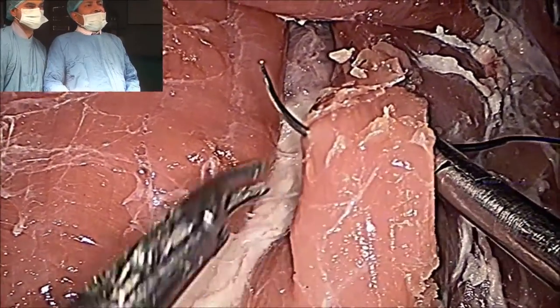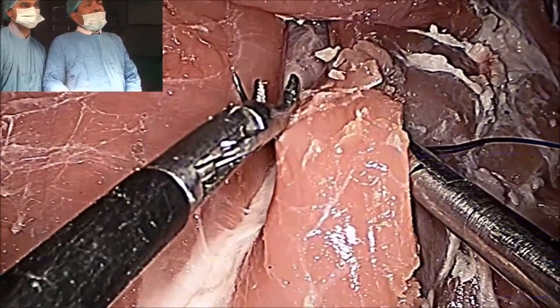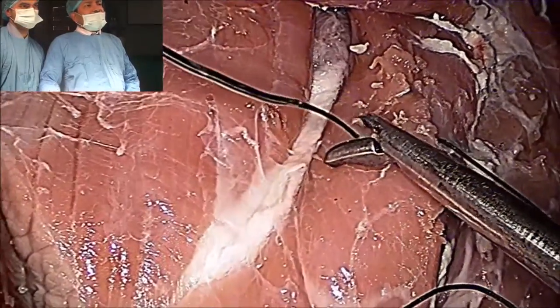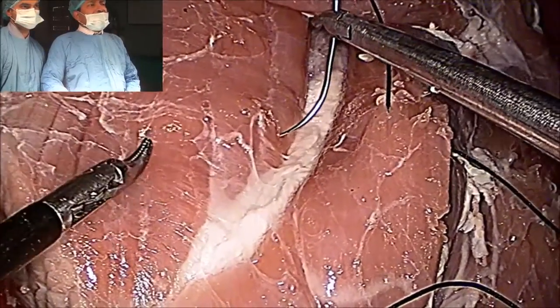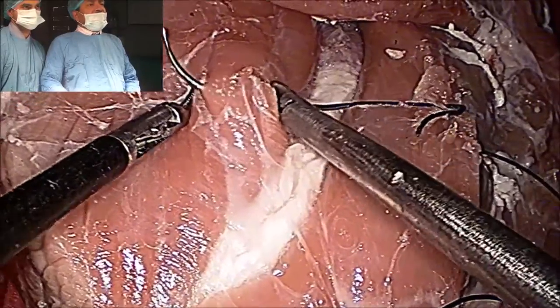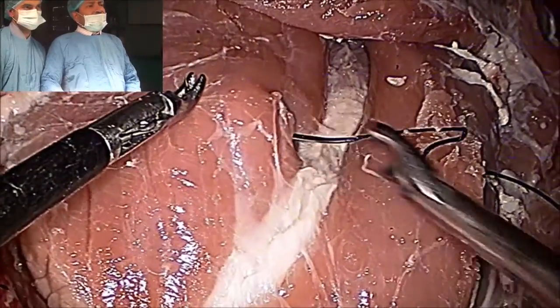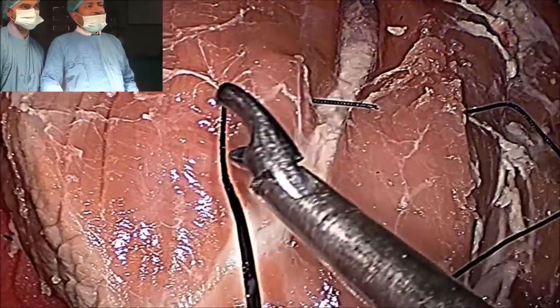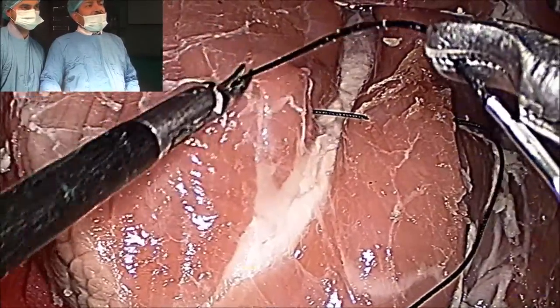Then I can approximate it by the tumble square knot. You will take a bite, turn the needle, hold the Maryland, guard it, again transfer the needle. Suppose this is another edge and there is a lot of traction in between. So in those situations, if you want to fill up this gap, then surgeon's knot is not good — you have to use tumble square knot.